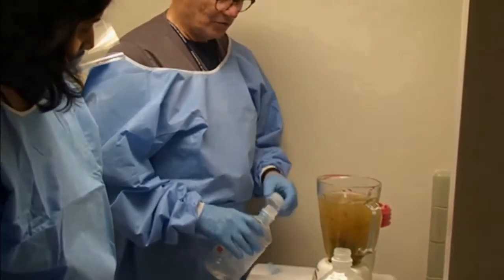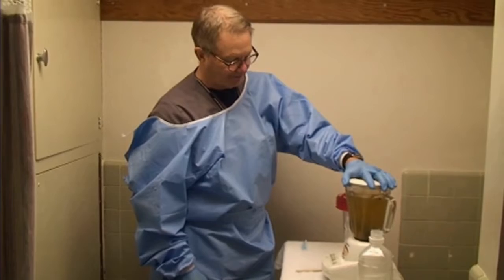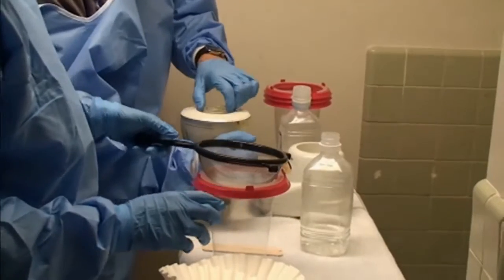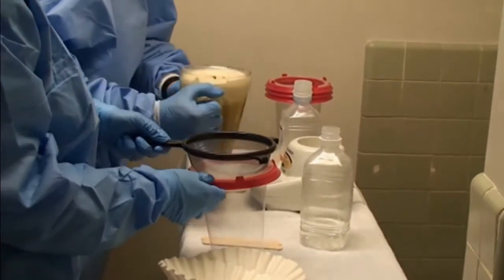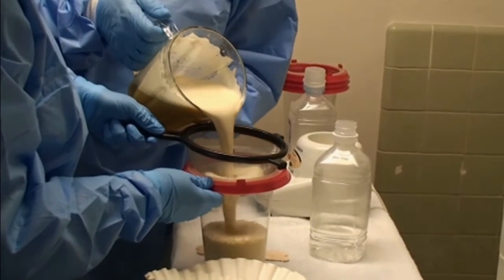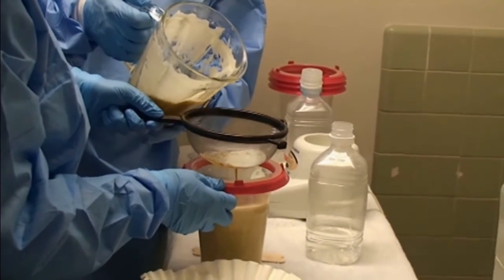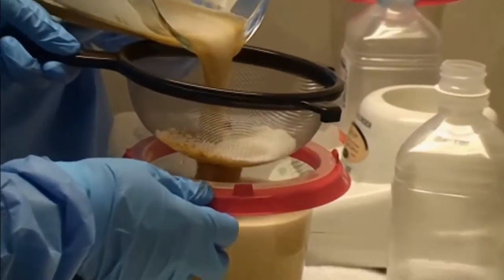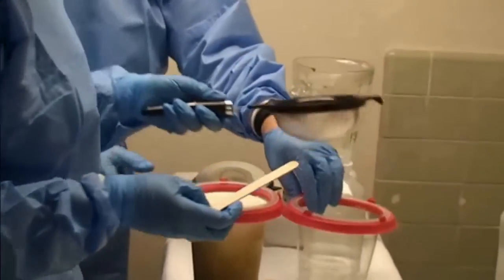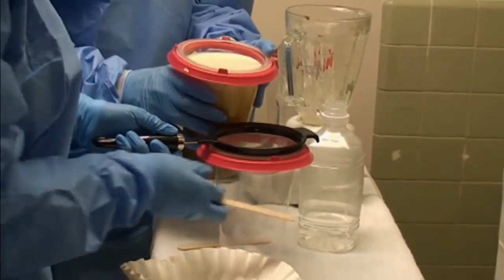Here we begin pouring saline into the blender in preparation for emulsifying the stool. At other institutions, water and even milk has been used as diluents. The emulsified stool is then removed from the blender and poured through the first colander — the coarse colander — which removes large particulate matter that could cause obstruction in the channel of the endoscope.